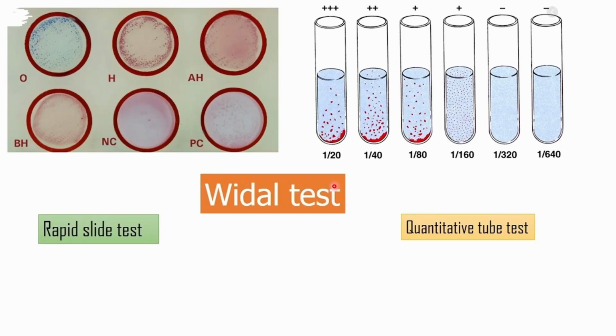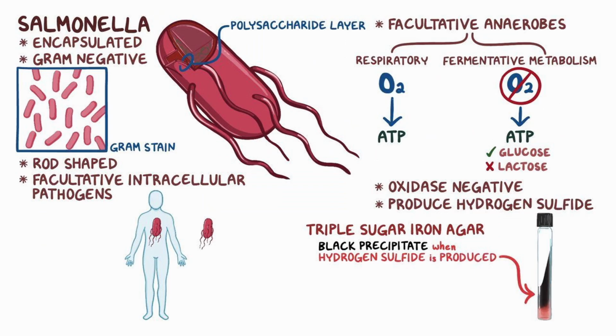Widal test. In this lecture we will understand what the Widal test is. It is a procedure in which we try to find out if the patient has enteric fever or not. Who is causing the enteric fever? A bacteria. What is the name of the bacteria? Salmonella typhi.